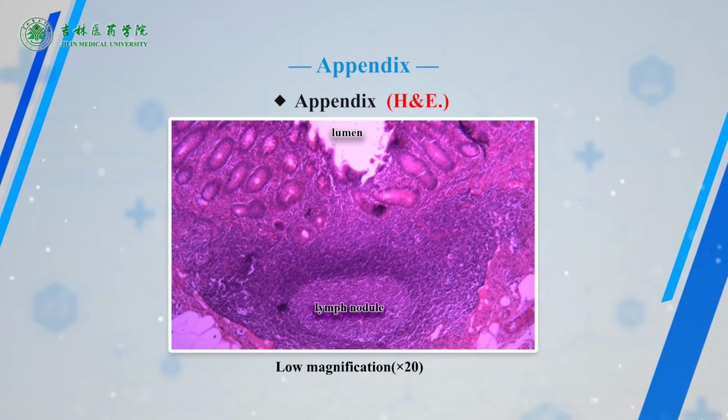The lymphatic tissue and the lymph nodules often penetrate through the muscularis mucosae into the submucosa. So the muscularis mucosae is often interrupted. The thin muscle layer is also composed of an inner circular and an outer longitudinal layer of smooth muscle.